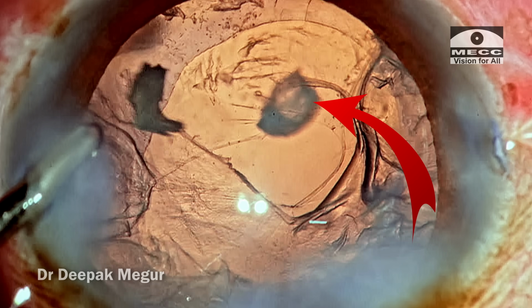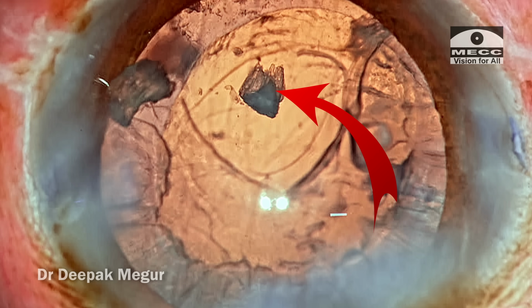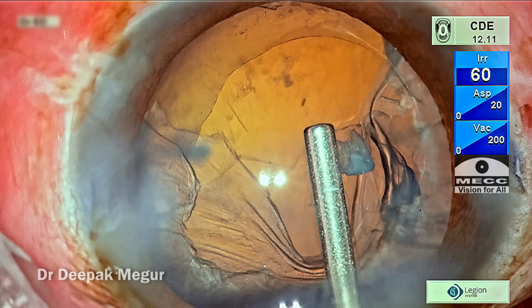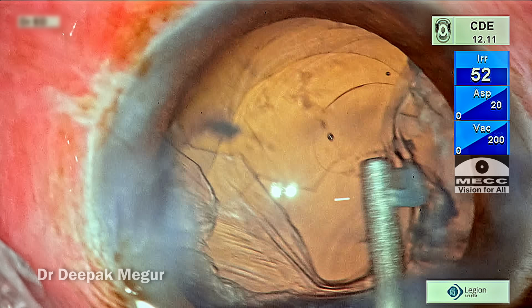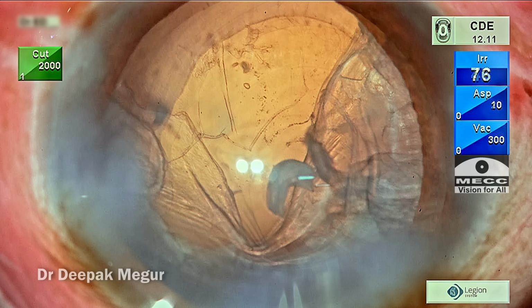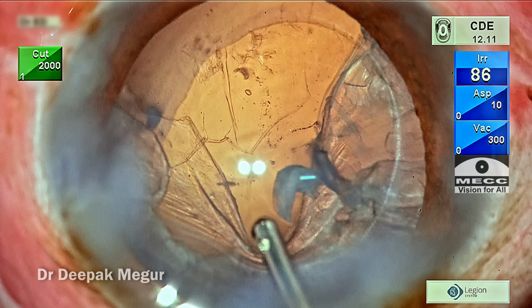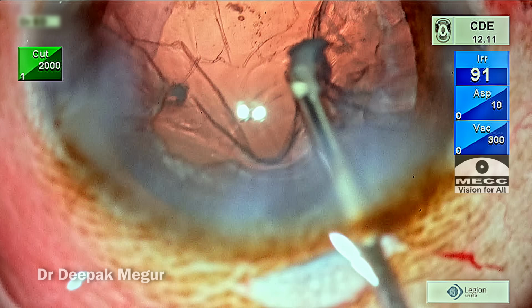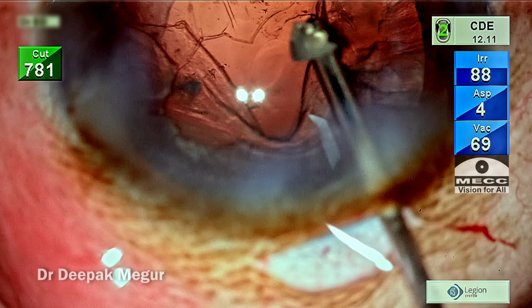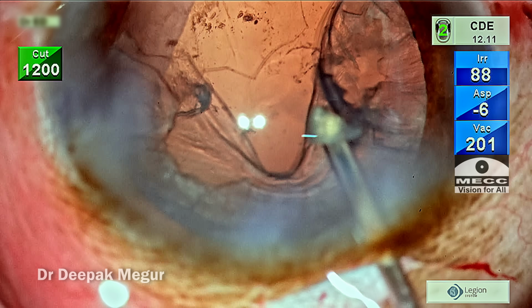At this point, I can also note a small nuclear fragment hovering just below the posterior capsule tear. So I'm just going to use the viscoelastic to nudge it more anteriorly. I'm pushing OVD behind it. Now, how do we deal with this small fragment? I'm just going in with my vitrectomy cutter itself. The chamber is maintained by OVD, and with the cutter I'm going to cut some of the vitreous which is around it, and then probably burp this fragment out of the incision.